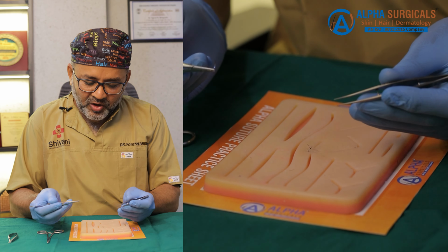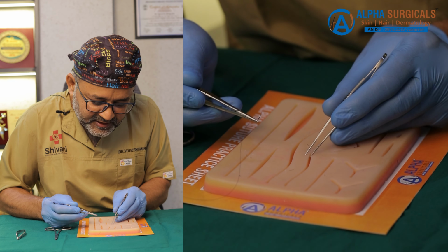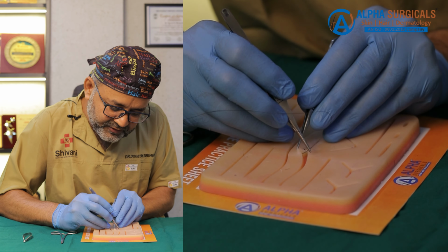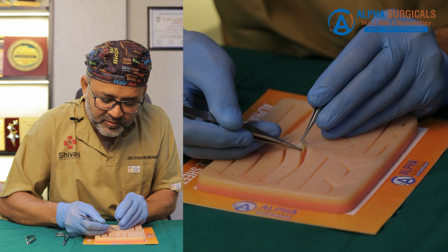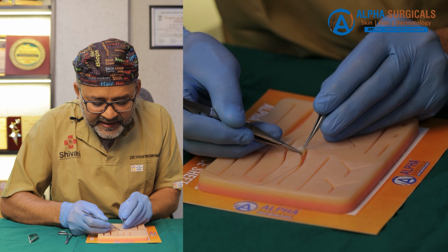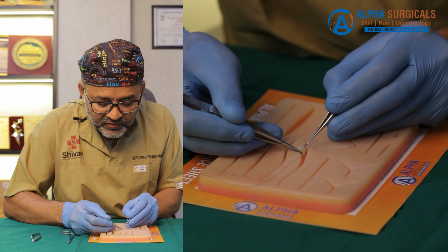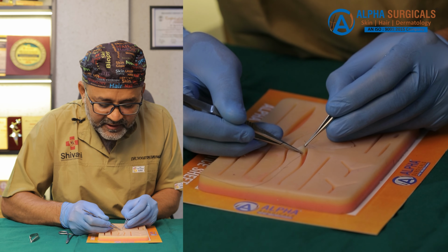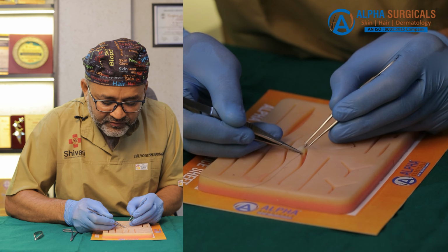So the placement of the intradermal stitch is in the lower part of the dermis. So I am holding the margin, taking it laterally so that I can see the lateral wall. Now giving a prick on the lateral wall, maybe 4 millimeter of volume in the lower part of the dermis. So if we can see, this is the surface, this is the lateral wall, and this is the bite taken in the lateral wall of the wound. The volume of the bite is almost 4 millimeter, and the depth from the surface is 2.5 to 3 millimeter.